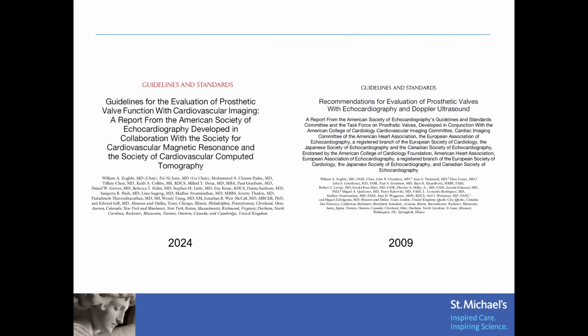So on the left is a new guideline. The previous one that we've been using so far has been from 2009. When you compare the two, they're mostly similar, but there are a few changes, and I'll try to highlight some of those changes today.